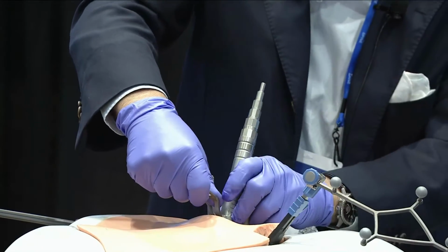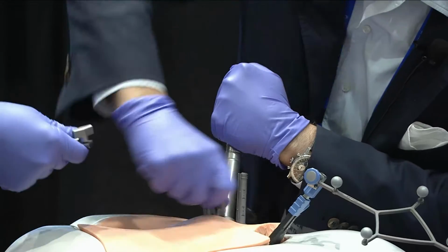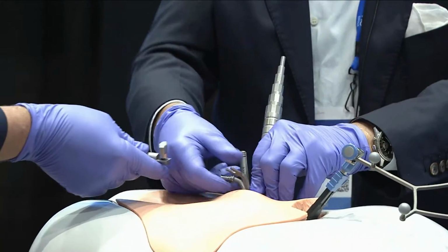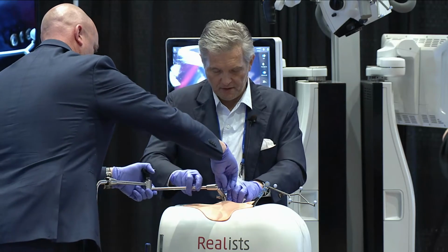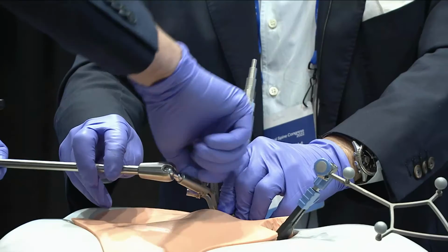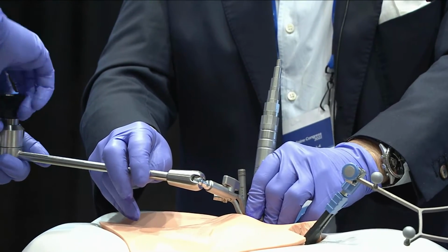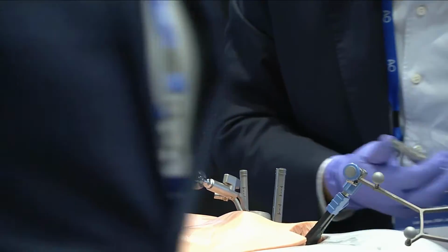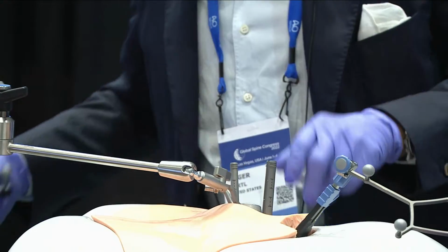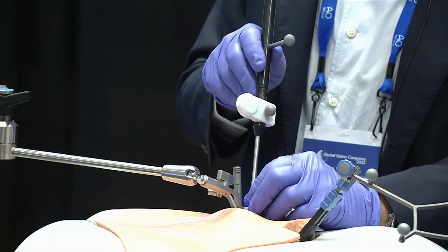And then Andy, if I can ask you to release this and then attach the tube to the holder. That's great. So I have a gentle medially angled, maybe 15, 20 degrees in the beginning, and then we'll confirm everything with navigation, so we're in good position. So now I want to know, where is the tube? Am I in the correct position? So I look at navigation.